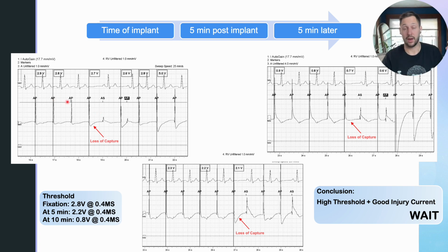So I'm now thinking, okay, I was driving it before. Now I'm not driving the rate. We have the intrinsic breakthrough, right? We're no longer pacing. It's been this whole time without any activity in the atrium. So the atrium is no longer suppressed. Doesn't always happen. Sometimes it gets suppressed for periods of time. It has its intrinsic breakthrough and then the conduction associated with this.